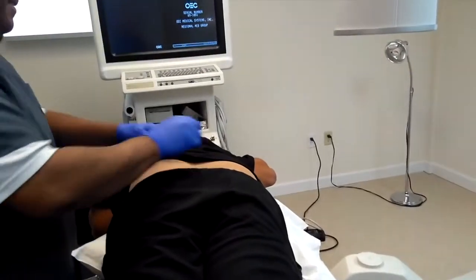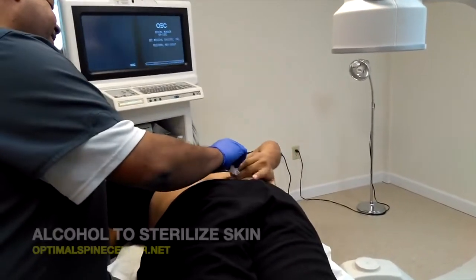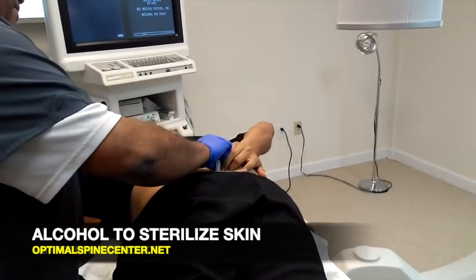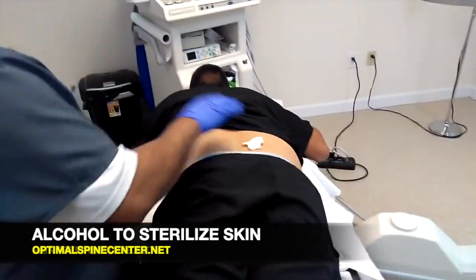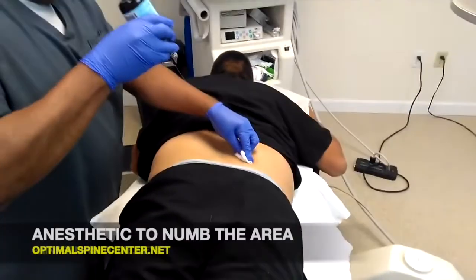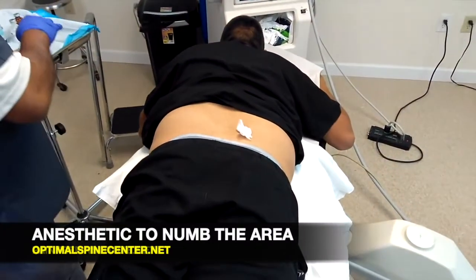So now I'm going to show you the actual procedure. It's very fast — it takes less than a minute, and the patient can go ahead and leave on their own without any assistance. During the procedure, the patient will lie down on their stomach with a pillow underneath the pelvis to increase the space in between the vertebrae. Then the doctor will apply alcohol to the skin to sterilize the area, and then he'll apply a local anesthetic to numb the area so that the patient feels very little pain.